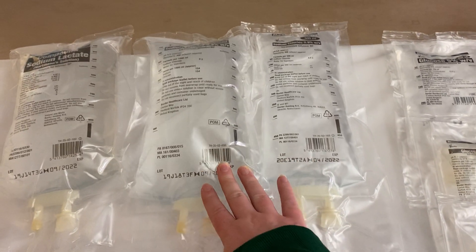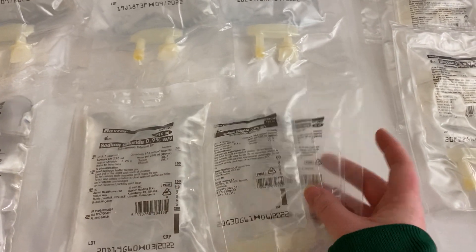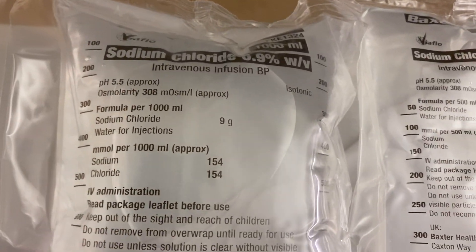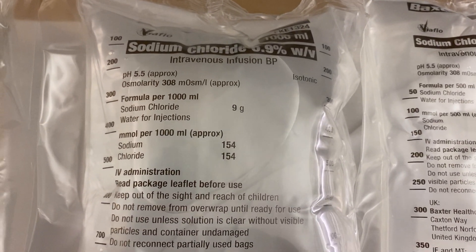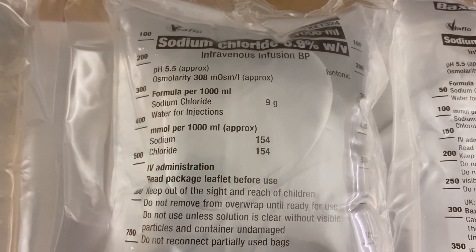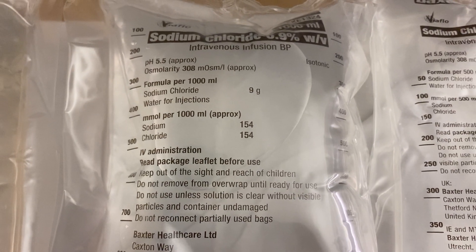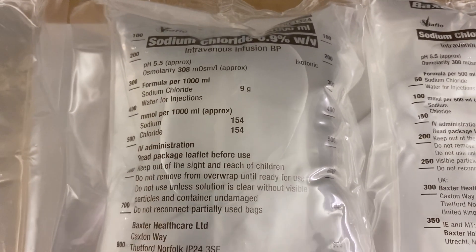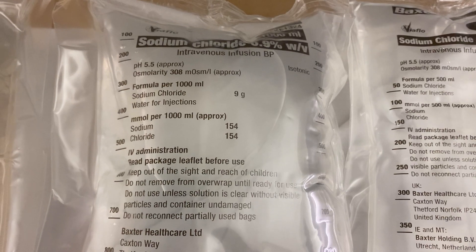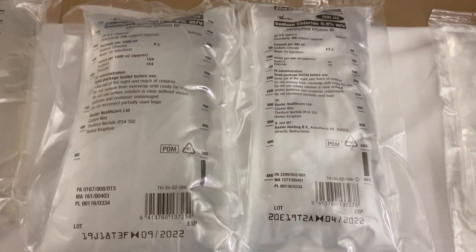These are all saline bags: one litre, 500 ml, 250 ml, 100 ml, and 50 ml — usually for mixing and giving drugs. The label shows isotonic sodium chloride 0.9%, pH 5.5, osmolarity 308, with contents in grams and millimoles per litre. It's isotonic, but the sodium and chloride are supranormal — much higher than in our own blood, with sodium usually up to 145 mmol/L and chloride usually below 109 mmol/L. We'll talk more about that in our PowerPoint lecture.